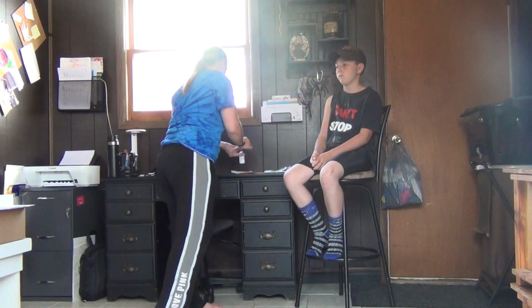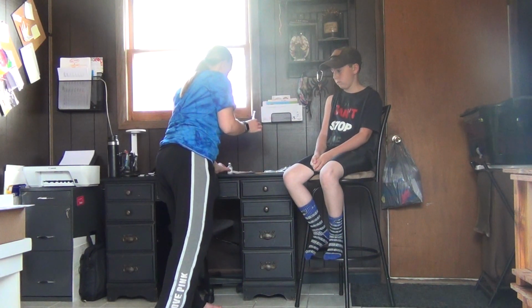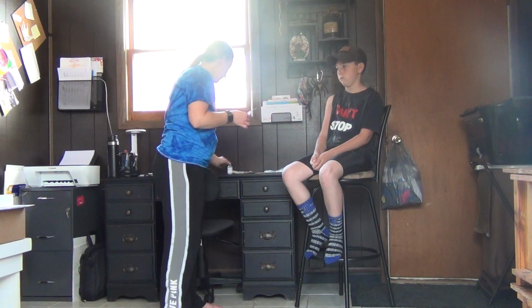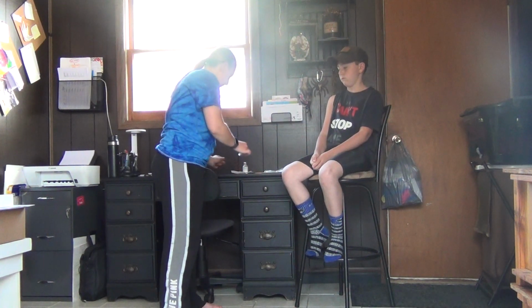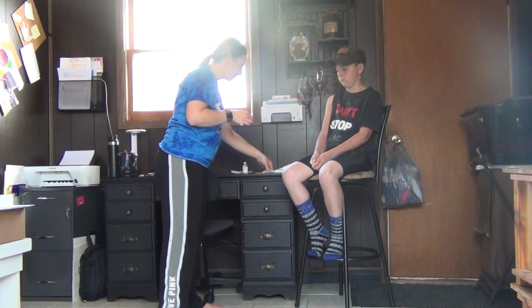Once everything would be good and in place for that, then I would go and take this out. And during this, I would have washed my hands prior and put on gloves, so I would normally be doing this with gloves. And then I would take this off and put it into a sharps, but because I'm going to keep it, I'm going to safely recap it, take it off, set it to the side.